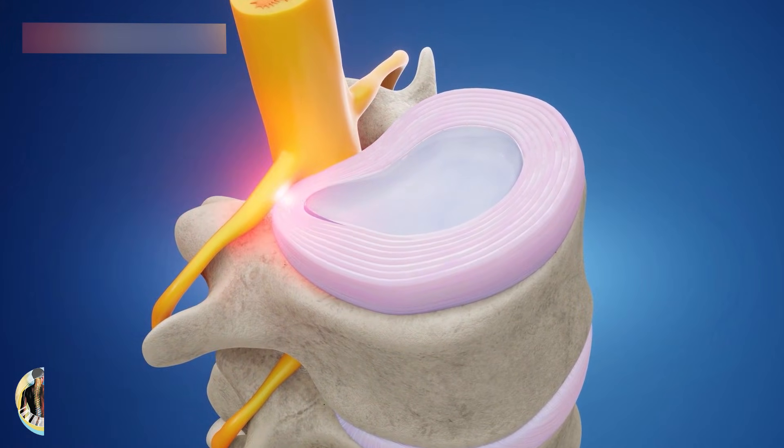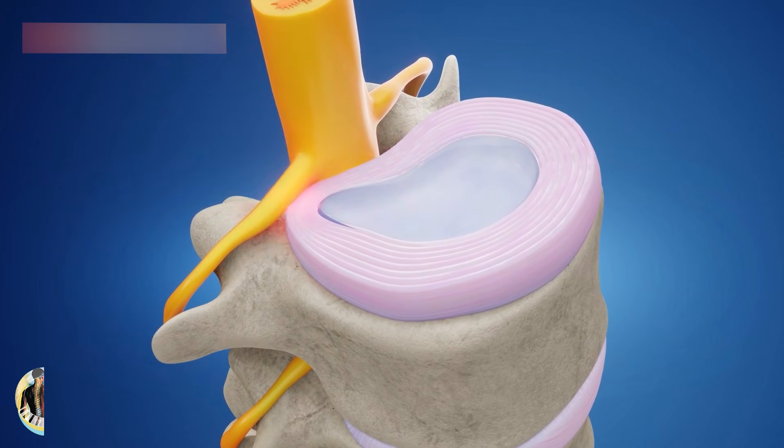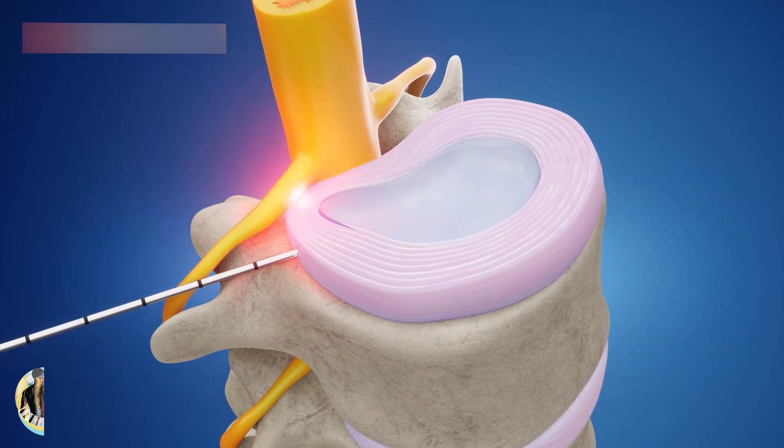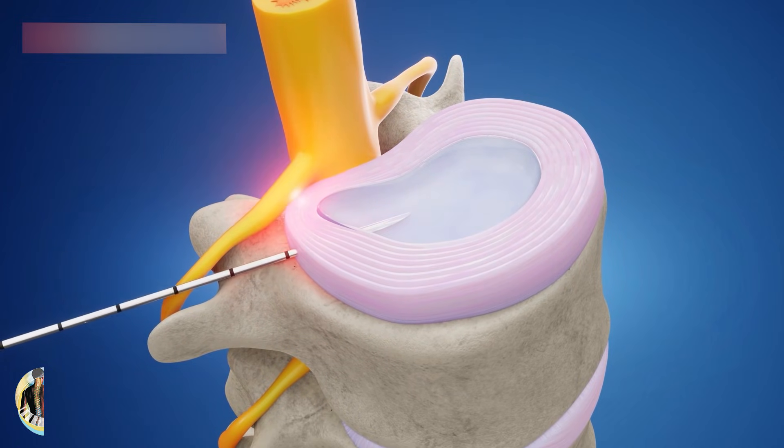The guide wire is used to direct a dilator and an endoscope into the disc, creating a larger opening. The wire and dilator are removed, providing a working channel.